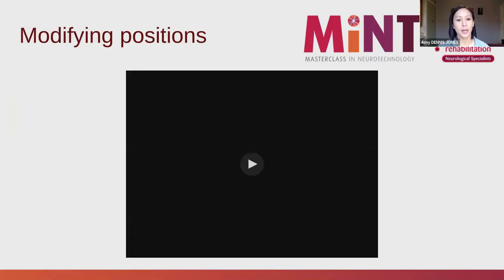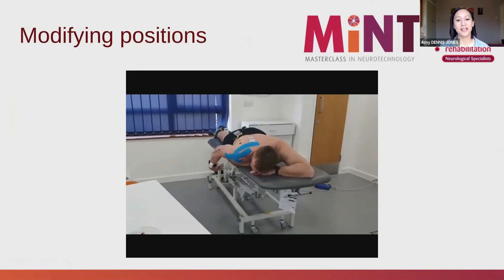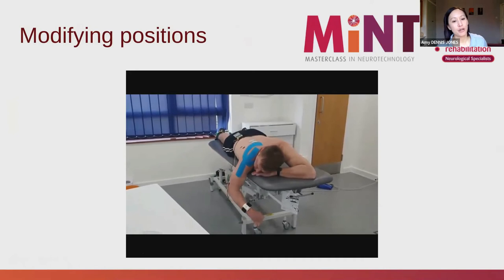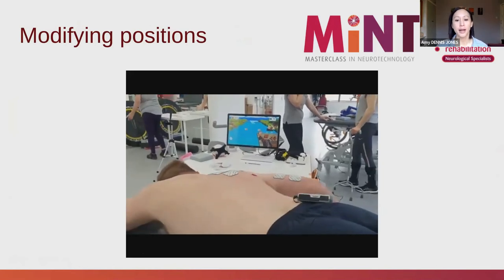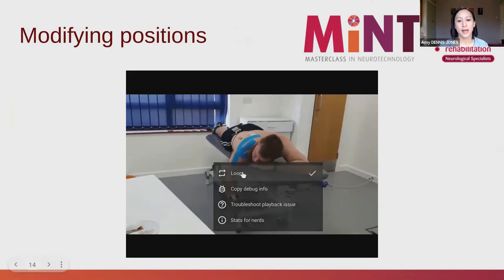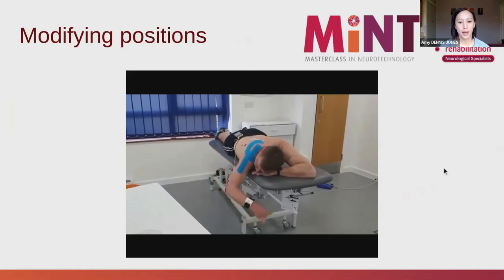And the last one we had a little look at, he really didn't like this one. So there's no sound because he's putting a lot of effort in. So here we also worked on that pull, that backward stroke you have, the pull down for your swimming element. And we used the FES again here, but we used it around the back of his shoulder blade to help with shoulder retraction and into his triceps to maintain that extension. And again, we used a Pablo sensor around his wrist to feed that into a game as well.